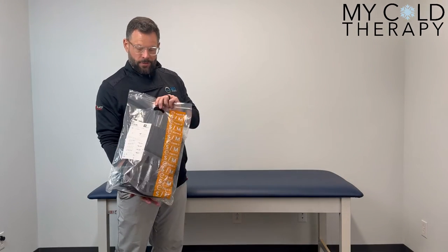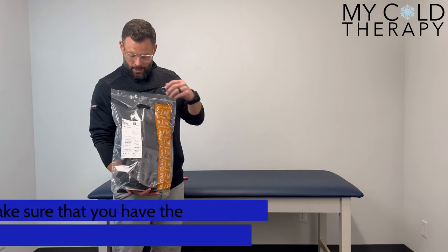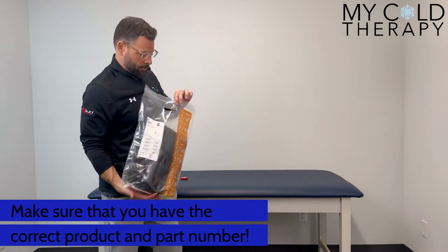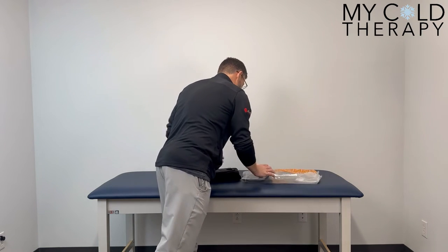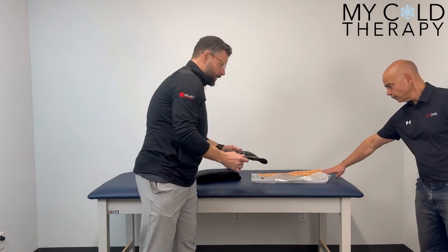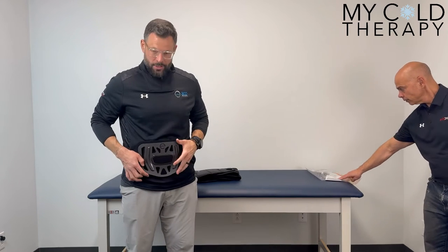When your Exos 627 arrives it's going to come in a bag like this, denoted as the 627. Taking this out of the bag, you're going to have two components with your brace. You're going to have your interior panel which is going to sit against the front of the abdomen, at the top of the pelvis.